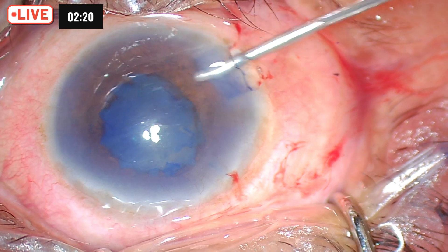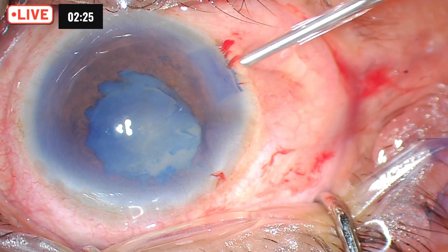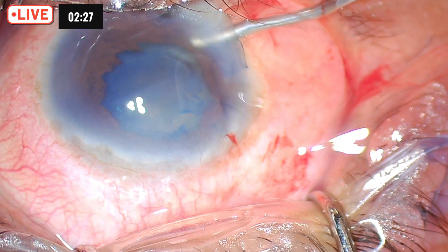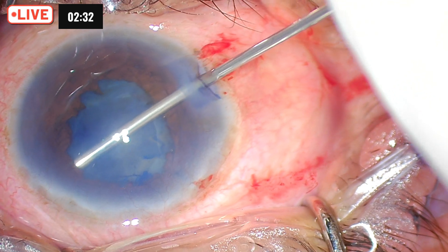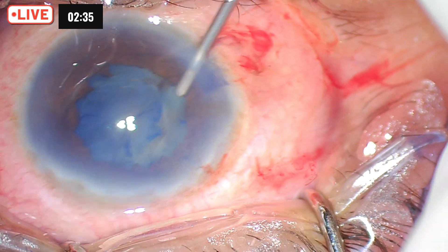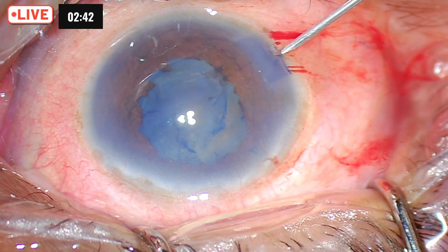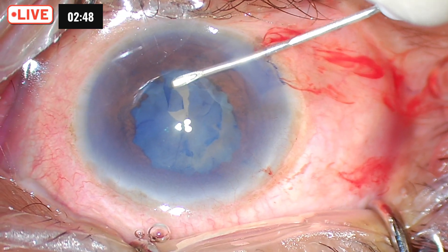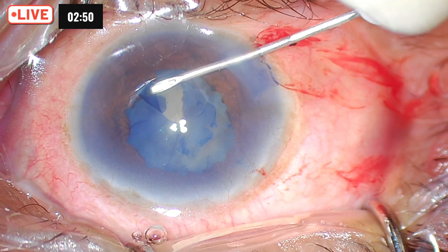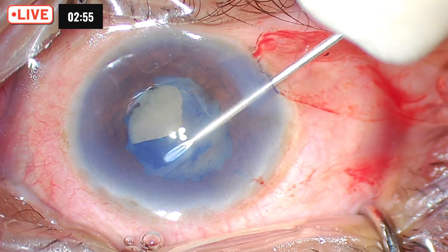We have made a reasonable-sized capsule opening. The cornea also does not seem to be very healthy. The next stage is to break all the synechiae which may be holding the pupil from extending further. You can choose to use forceps or whatever you are comfortable with. Always aim for a larger rhexis in a case of pseudo exfoliation because the incidence of capsular phimosis is very high.